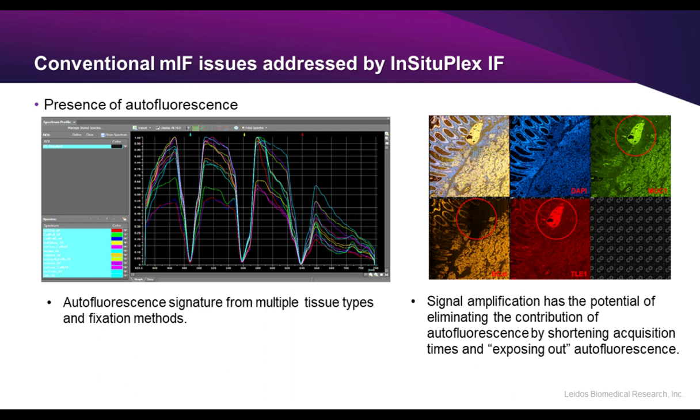I'd say where you want to run multiple markers in a high multiplex situation is when you have specific questions on these relationships between the markers you're looking for.